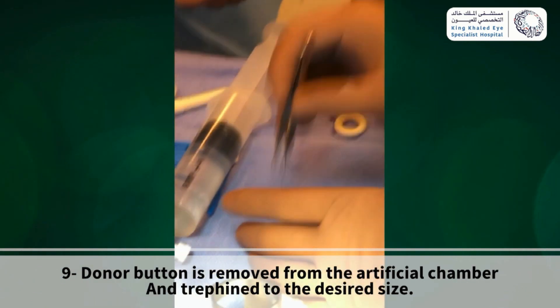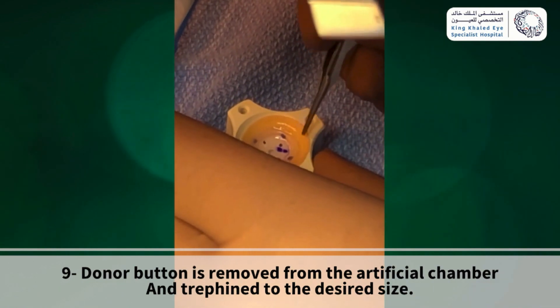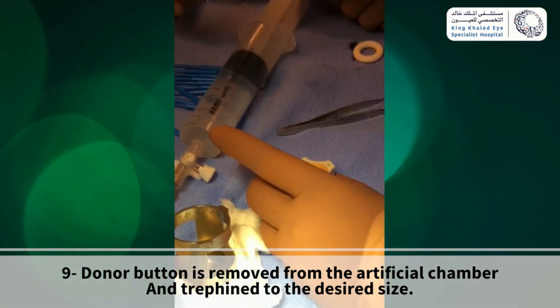Make sure that the endothelial side is up and make sure it is well centered as well before trephining it into the desired size.